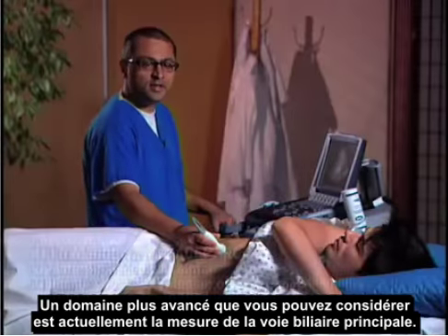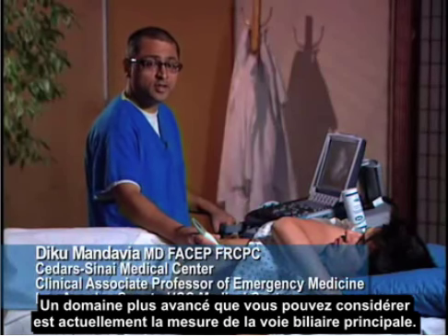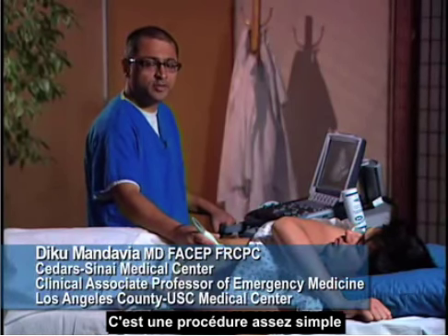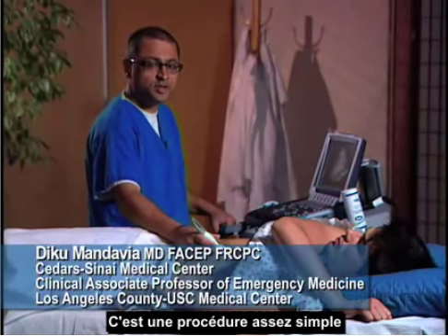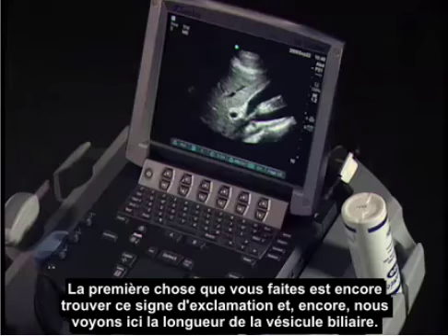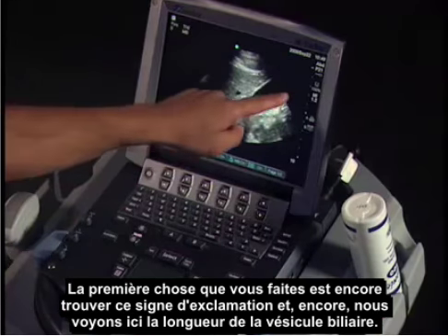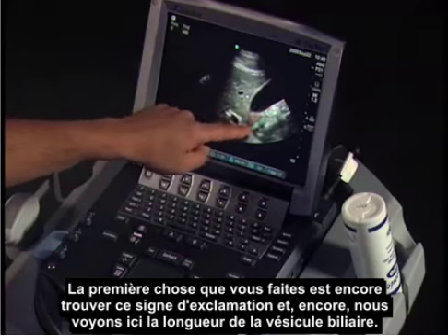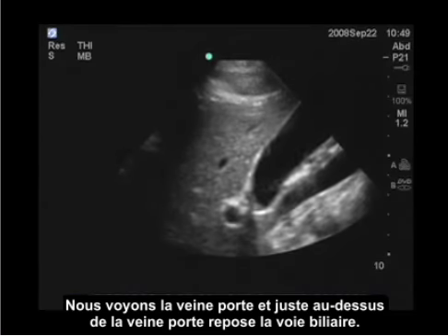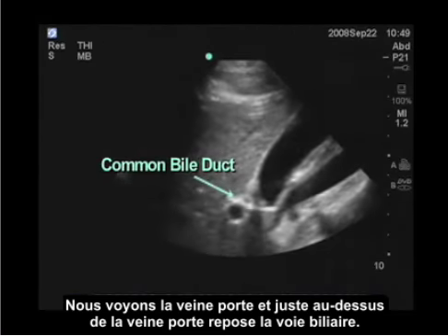A more advanced area you may want to look at is actually measuring the bile duct. That's a pretty straightforward procedure. The first thing you do is find that exclamation sign, and we see it here with the gallbladder and the length. We see the portal vein, and just above the portal vein lies the bile duct.